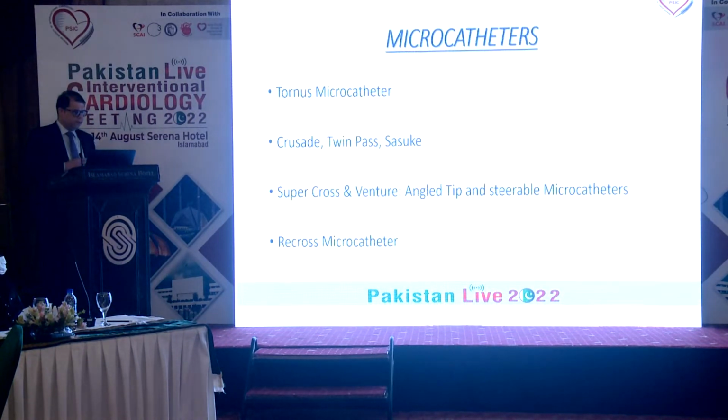There are some microcatheters like the Tornus. They can be sort of screwed into the plaque and help you progress when normal microcatheters are not passing. We also have dual lumen catheters, which can be useful in CTO PCI, like the Crusade, Twin Pass, and the Sasuke.